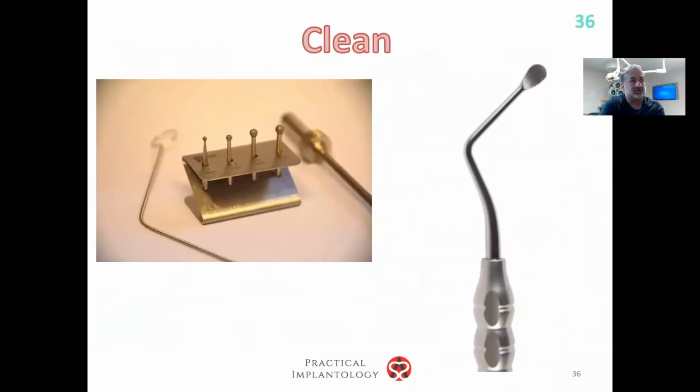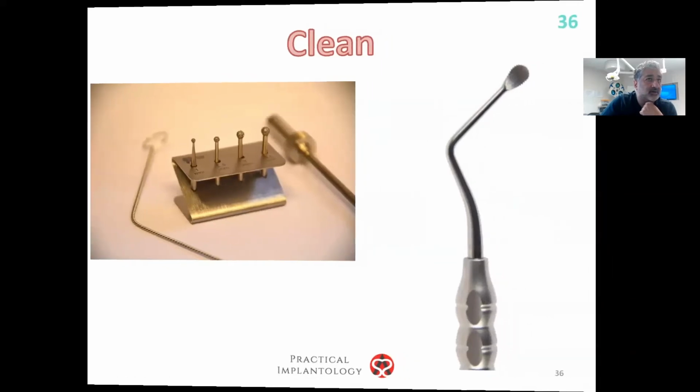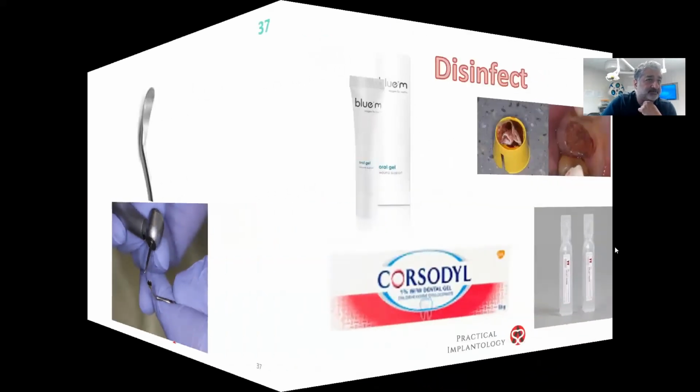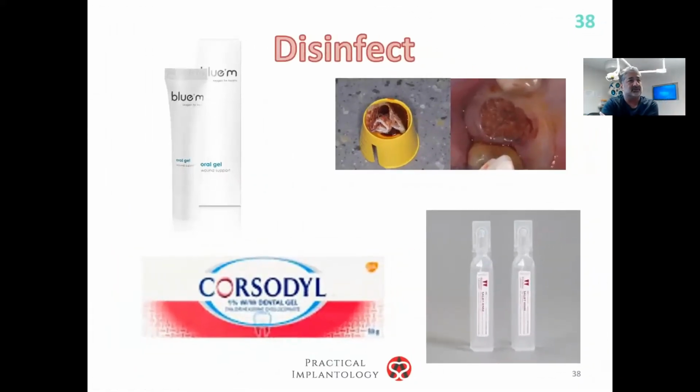When we clean the socket, we use a curette. It should be a serrated Lucas curette. And then we also have these degranulation and cortical decortication burrs, fantastic burrs. Another way of getting a nice Lucas curette is to get a Michel's trimmer and a very sharp burr and just serrate it around the edges. It creates some really nice sharp points and a lovely serrated curette.